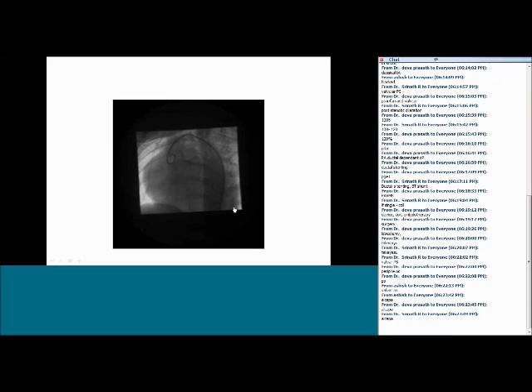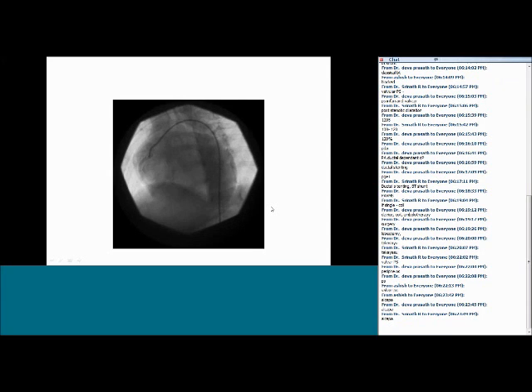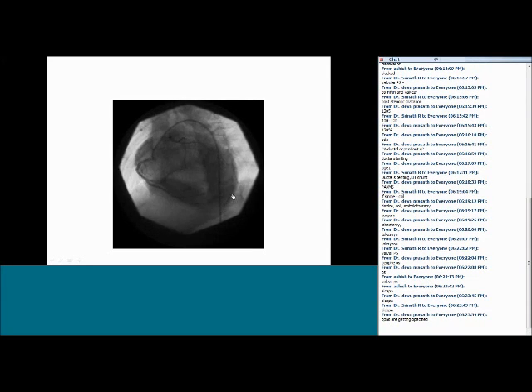So the purpose of showing this angio: a right coronary angio showing the retrograde filling of the left coronary artery. Any patient coming with the diagnosis of dilated cardiomyopathy, we should look at the coronaries at all the visits. The same patient will keep coming to your OPD for medication adjustments to check the EF.